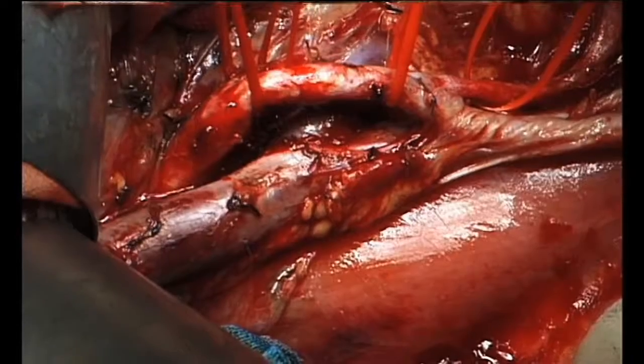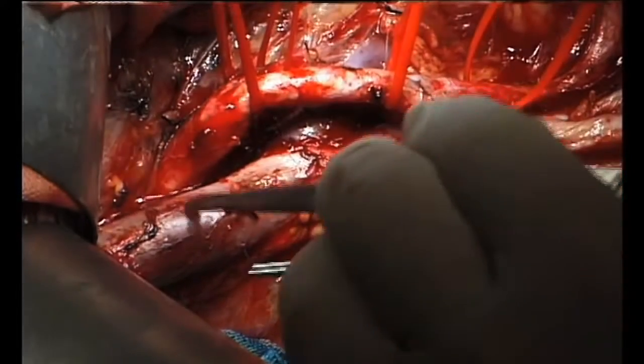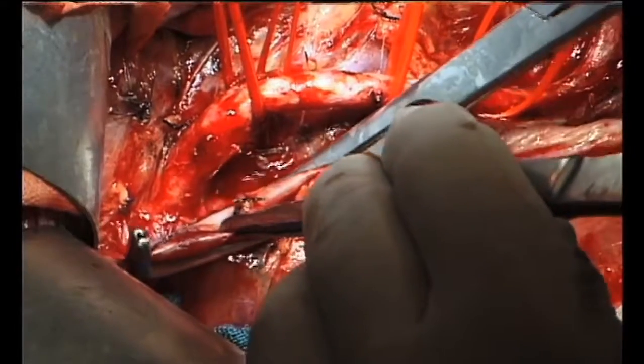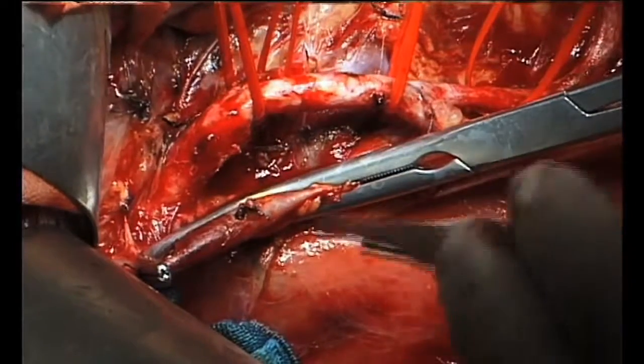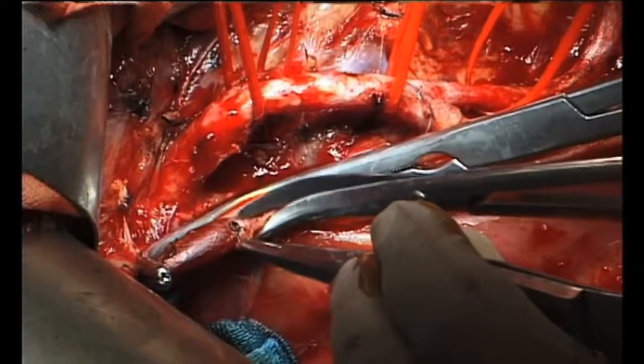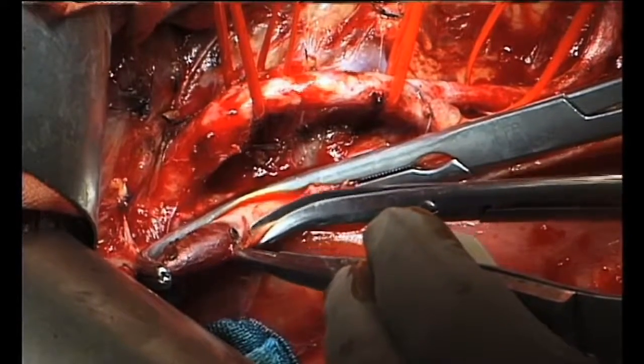The graft bed in the lumbar region was prepared. The site for venous anastomosis is chosen, and the inferior vena cava is clamped by a Satinsky clamp. A caval patch is then excised.